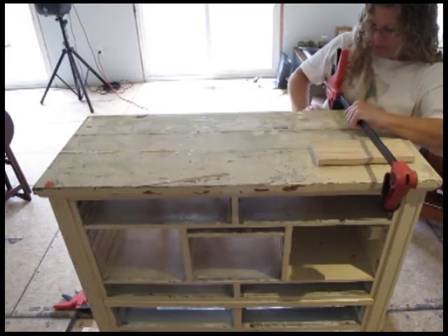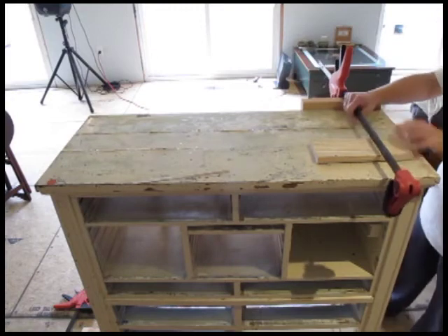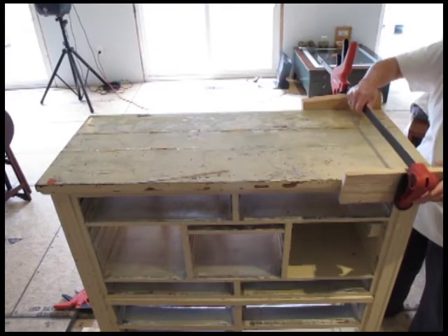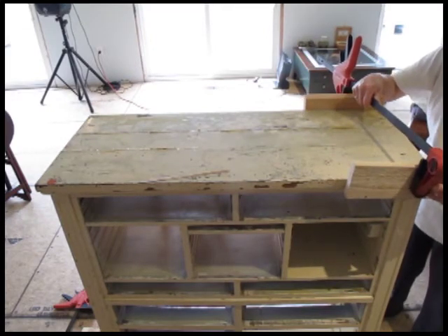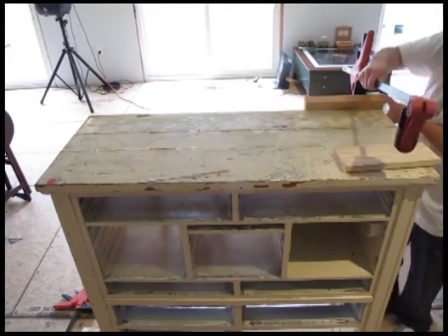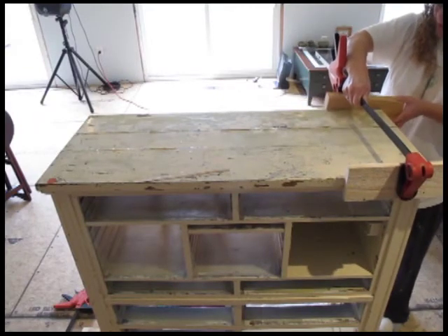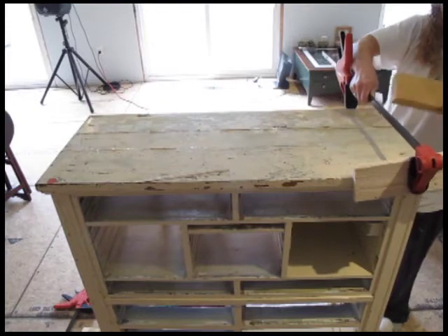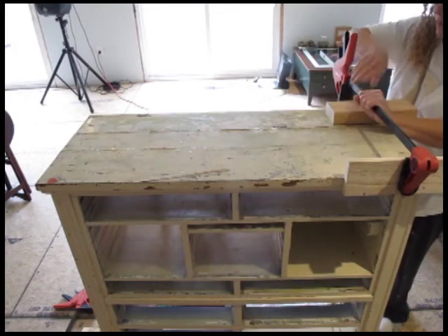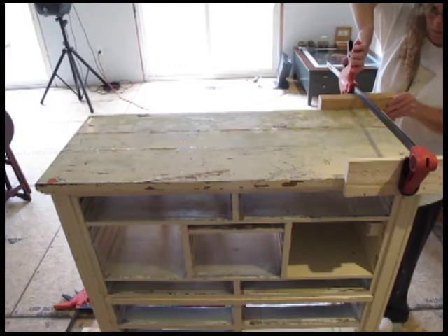How do these people do it by themselves? Mr. Johnson, you make it look so easy. Okay, so what I need to do is hold both in place at the same time before my thing dries. Okay, so what I need to do is put this one in place, come back here to this one. This is where I need that damn third hand. Okay, hold this one in place, but I'll hold it at the handle. Okay, now I'll hold this one in place.